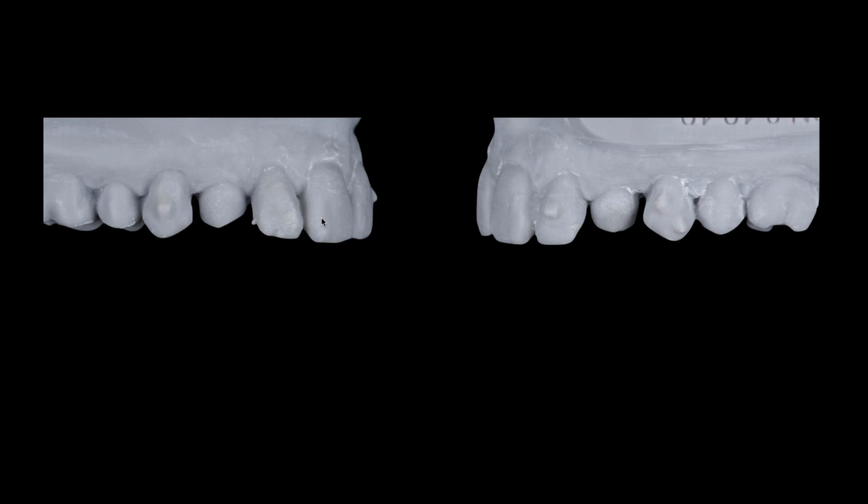What I can't do well, and I know my machinery does it, so Rich is probably shaking his head right now, is that I can mount this on an Artex and go in there functionally 100%, I can. At the same time, I could have two casts in my hand and really work through it, because as great as an articulator is, nothing works as well as the mouth. And I can see a lot more of the movements by hand with two casts on full arches sometimes than I can with almost any articulator in the world. Doesn't mean I'm not an articulator fan. I live by articulators. But I also live by the reference that the articulator is not as good as the mouth. That is the ultimate in articulators.